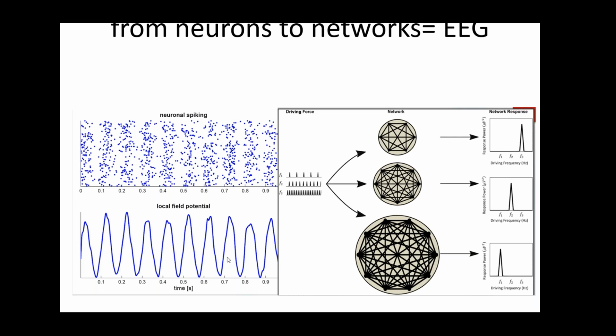So the EEG is composed of multiple frequencies. You have slow frequencies, which we call delta waves, and I'm going to try to be as generic and basic as possible. I'm not sure about the audience's training, so forgive me if I'm too simple or too complex.